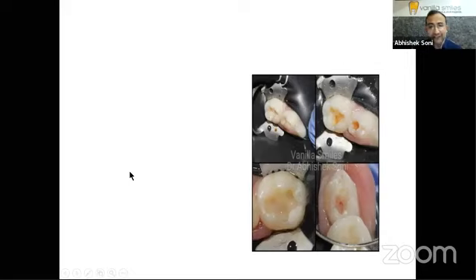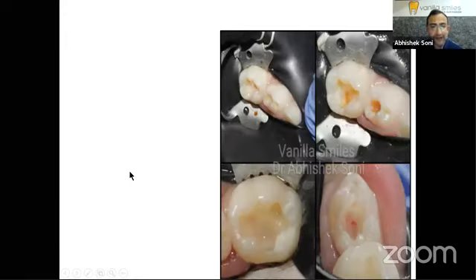So you can see 75 and 74, non-selective removal. You had a pulpal exposure with 74, and you can see the shadow of the pulp in 75. However, there was no carious pulpal exposure with 75.